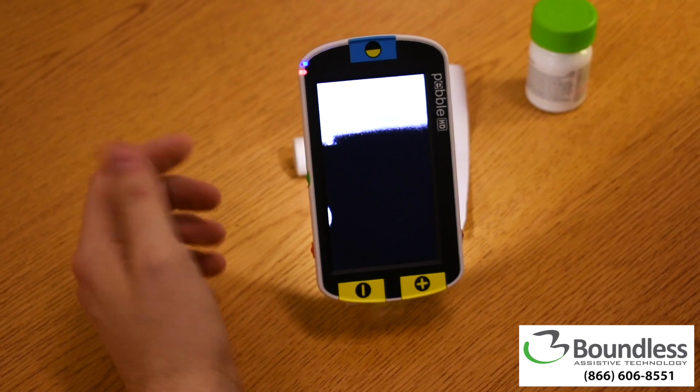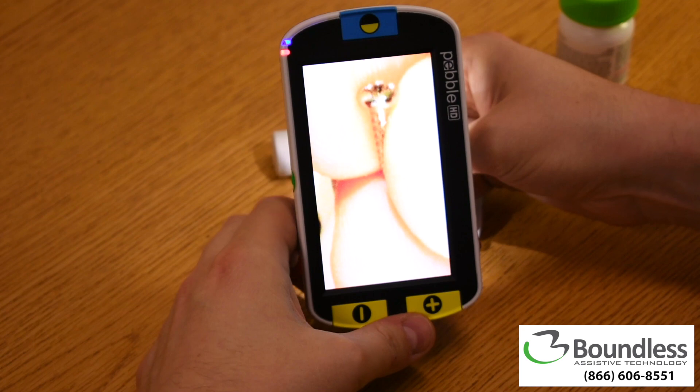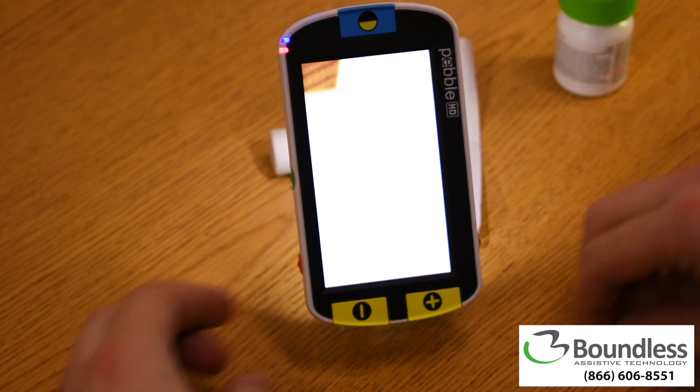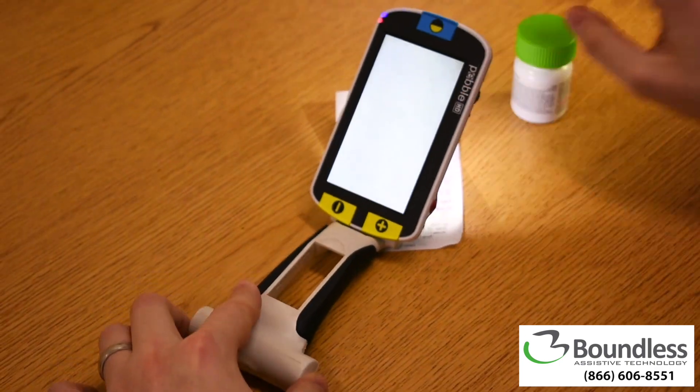You could also use this to take a look at smaller objects that require a little bit more dexterity. Alternatively, signing checks can be simplified by tilting the stand like this.